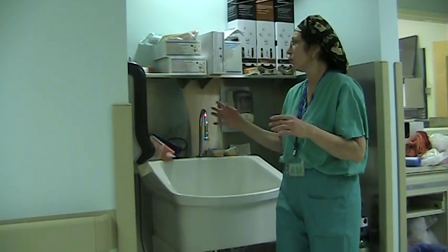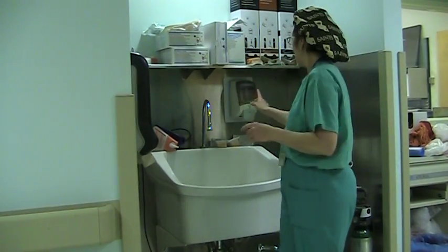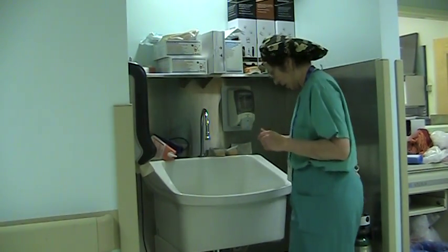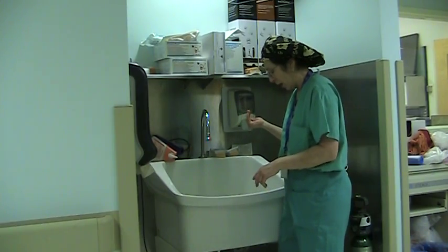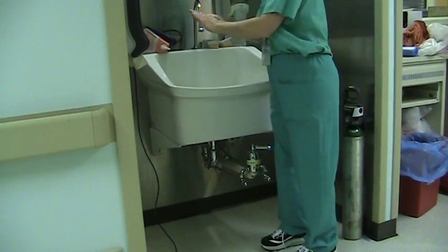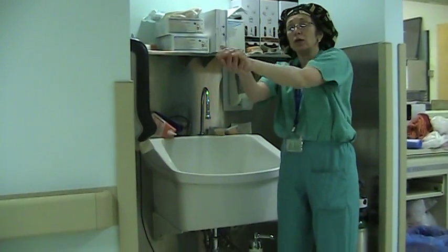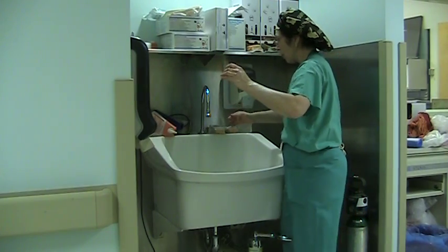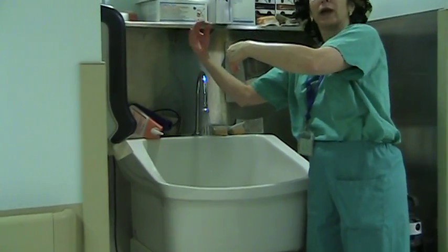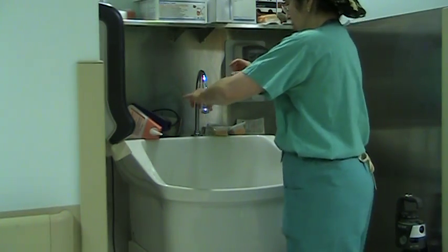The first step is called degreasing, which just means removing the basic oils from your skin. Every sink has soap at the sink side. Take a little soap, a little water — and I'm going to turn the water off as I work because we want to save water. I go ahead and degrease, and when I rinse, I run my hands in an upward position so the water flows downward and off. I do the same with the second hand.